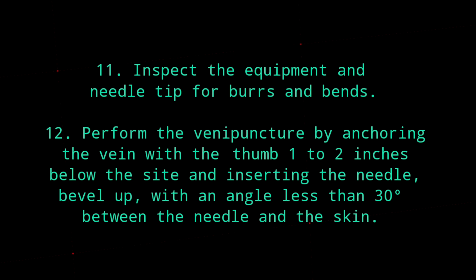So, kailangan is tingnan mo yung needle kung okay pa ba siya, and ako, yung barrel ng needle is tinitingnan ko talaga kasi minsan meron siyang air. So, i-push mo yun. Kailangan mo siya i-push kung may air siya. And sa pag-anchor naman, dapat 1 to 2 inches siya below the site. And always, sa pag-insert ng needle is bevel up.